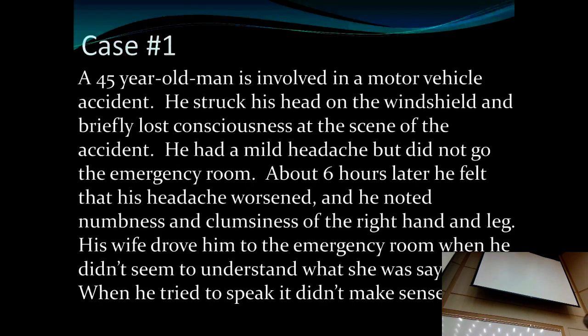So none of that will be asked on this test. All right? That was just a quick run through. But it would be really important that you know everything else that we just said before. What are the advantages and disadvantages, CT, MRI scan? What are the indications for both? Make sure you know that.